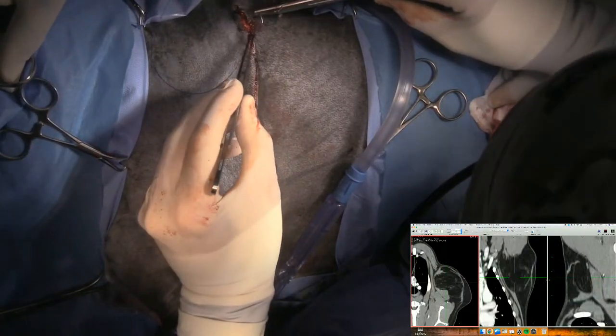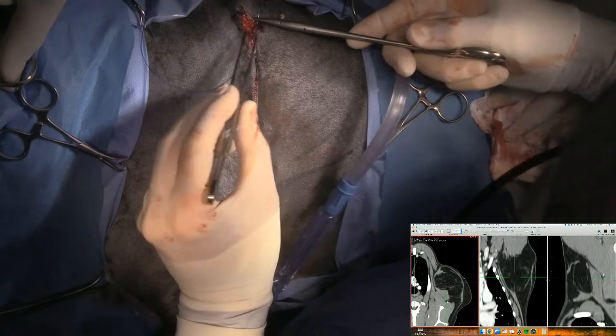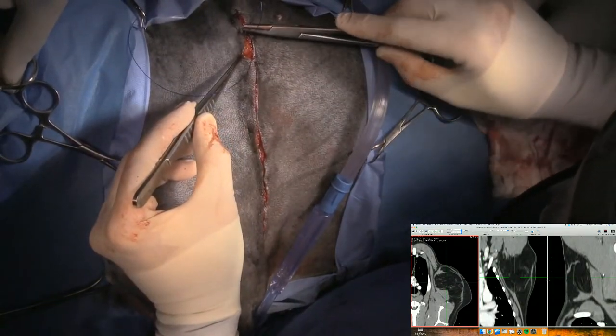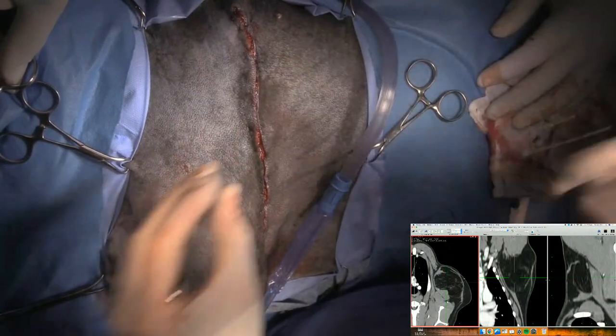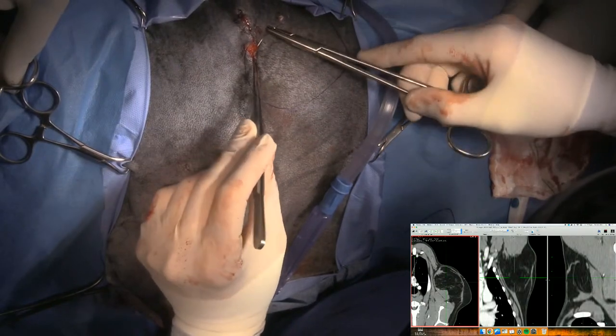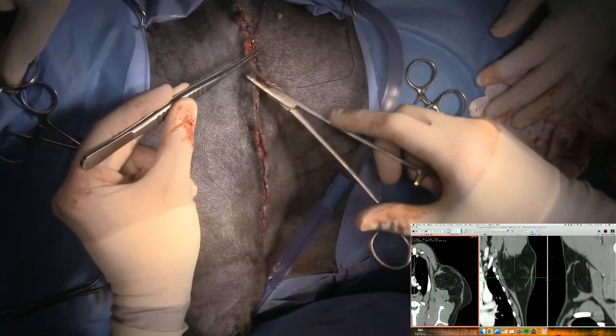Just because they're more secure. So rather than a surgeon's knot, I prefer a square knot. The algorithm is supposed to block those bots.